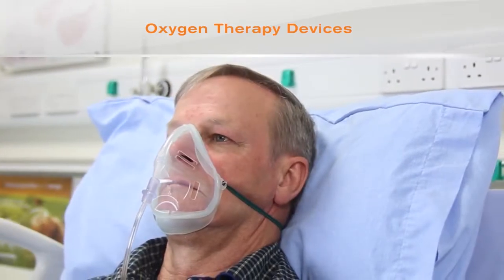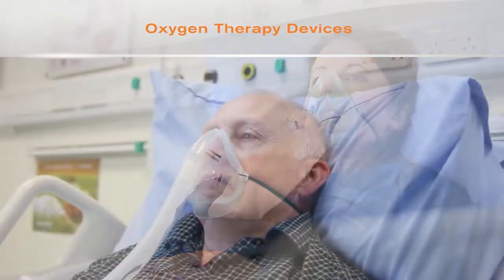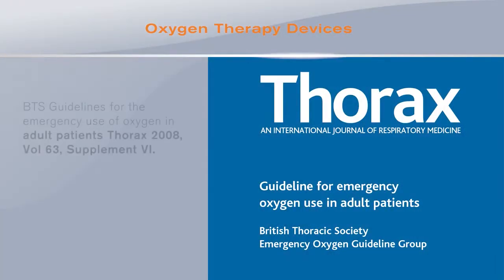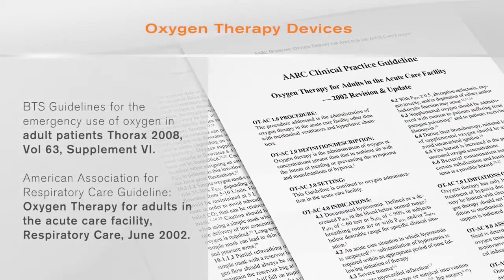This video covers the main types of device commonly used for delivering oxygen therapy, which enable clinicians to comply with guidelines published worldwide, such as the British Thoracic Society Guidelines and the American Association for Respiratory Care Guideline.